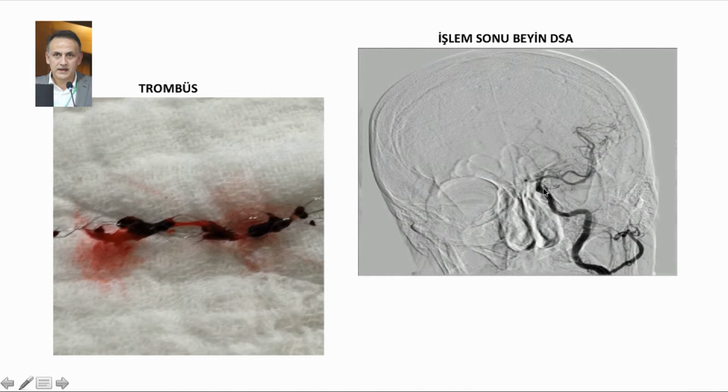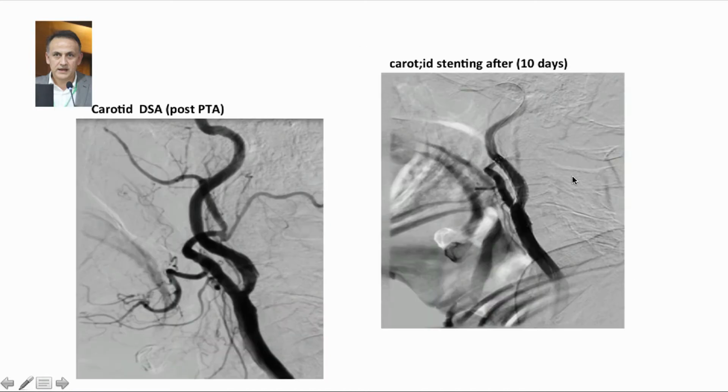And in here we sent a stent retriever system. This is Eric, and we have some thrombus, and this is after thrombectomy. In this patient, we did the stenting after 10 days, not at the index procedure.